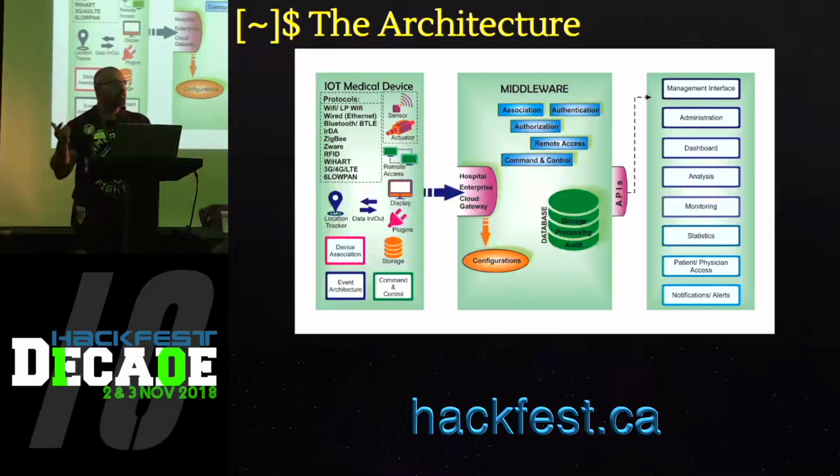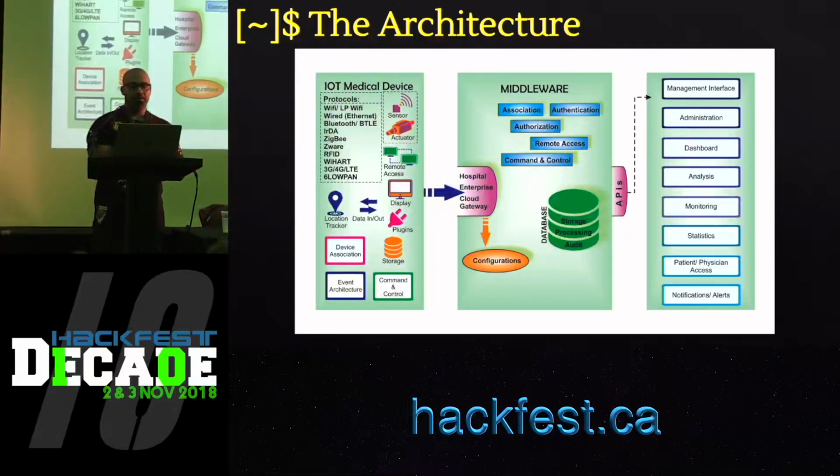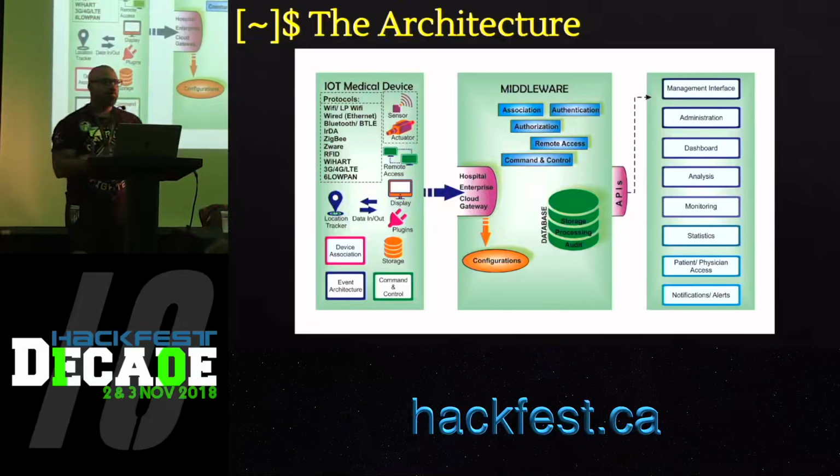Then there's middleware, and you can think of middleware as the application server for your medical device, and that has most of the logic for authentication, authorization, remote access, and so on. But the most important part of middleware is going to be the storage, processing, and audit, the data storage part of it, because that module takes or aggregates data from all these different medical devices and then outputs consumable data, which can then be fed into different kinds of portals. So device manufacturers can access that data to see how the device is behaving in different scenarios and then better the device using that data. It can be used by security researchers across the globe, and by your doctors to take preventive measures based on your condition, and so on and so forth.